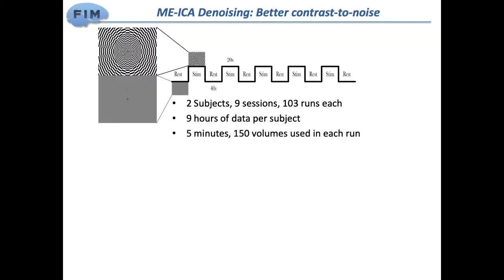The last study I'm showing addresses one of the main questions I often get, which is: what is the magnitude of this typical signal boost? So in this study, we scanned 2 subjects across 9 sessions. It was over 100 5-minute runs of a block design checkerboard task. So, a classic: hit the visual system as hard as possible.